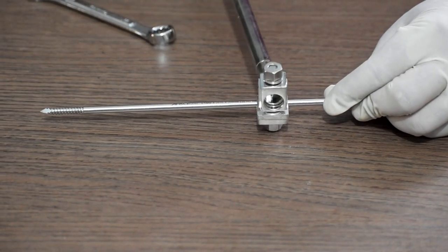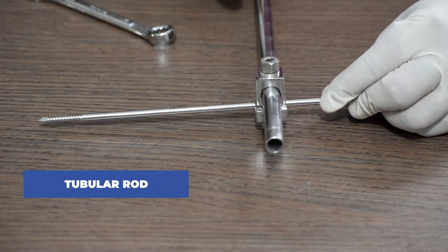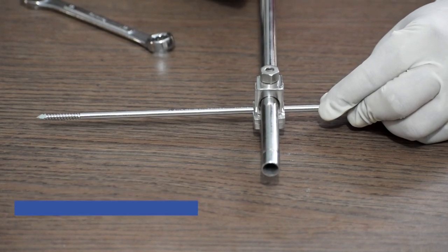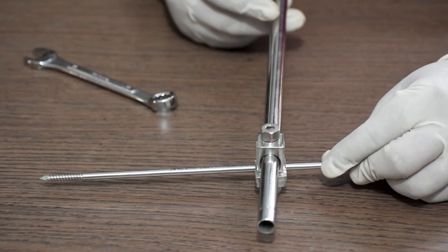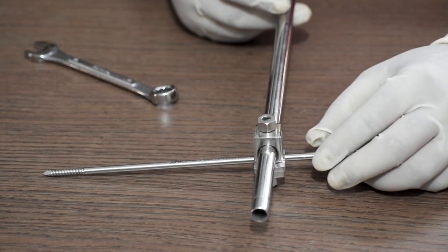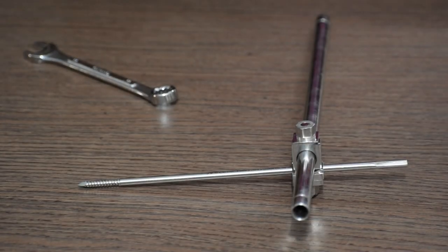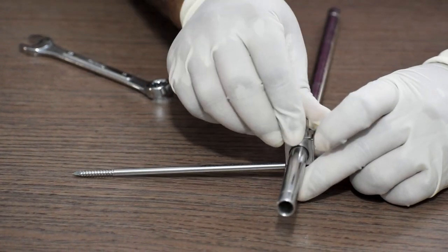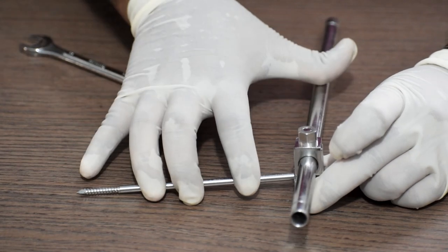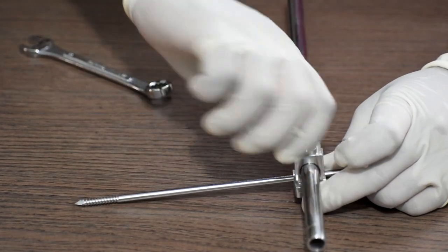Next, in this hole, we will be inserting the tubular rod. This is the tubular rod. Once you have aligned the tubular rod, we will have to do the final tightening with the help of the spanner on this nut.